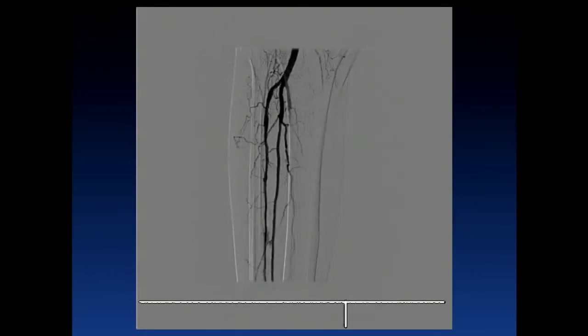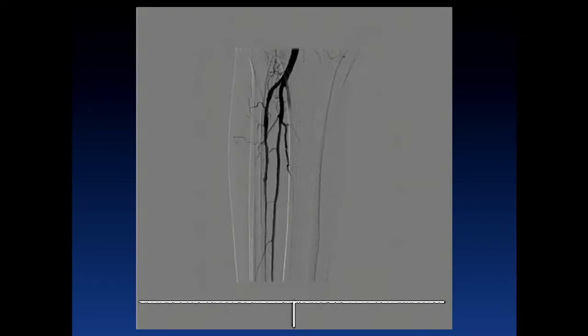So tibial perforations, actually, I hear about a lot of them, and I have seen them with different people when they present their cases. And I think it's just the nature of the disease. First is one thing is the nature of the disease, the calcification is in the area. But other things I have also seen when people go down with the wires, right? Sometimes you have your wire exiting into these small branches, and if we are in a little rush and we don't control that, they can just perforate those small branches.